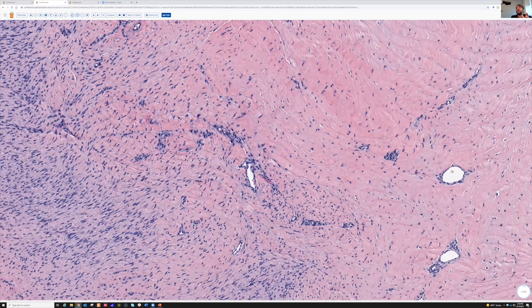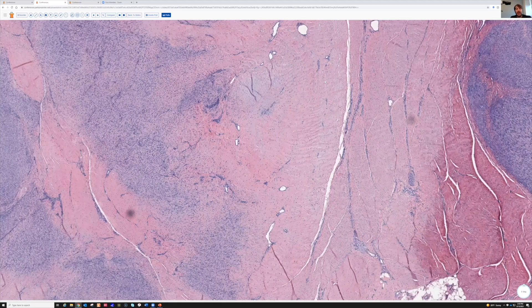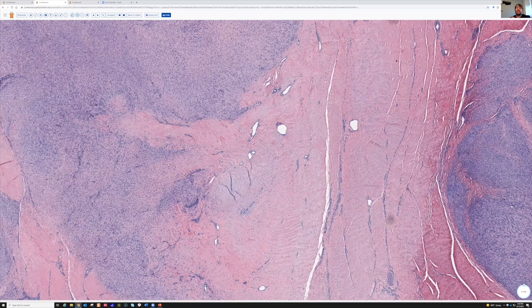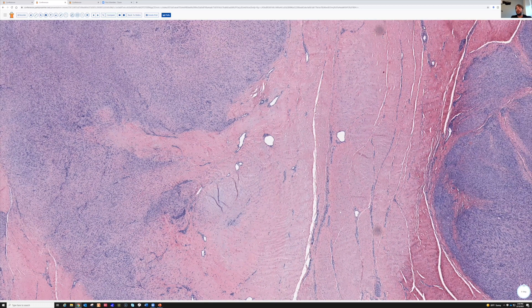I always like to teach this normal histology stuff because sometimes it tells you a lot — maybe the surgeon gave you the anatomic site, but this can tell you a lot about how deep you are and exactly where you are. We know here we are down deep, at the tendon sheath level or deeper. And coming off of this, we have a kind of cellular, kind of blue tumor.